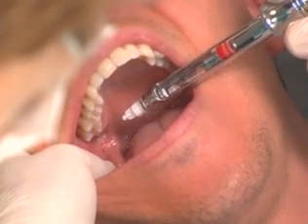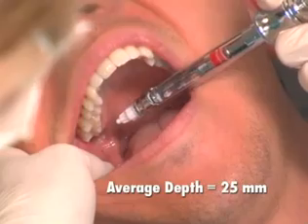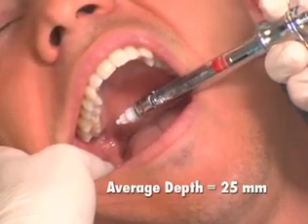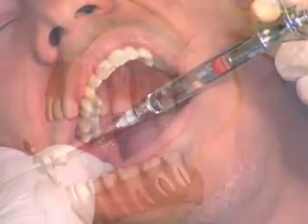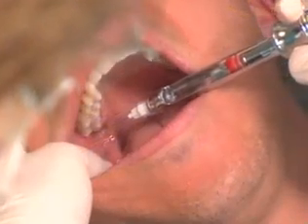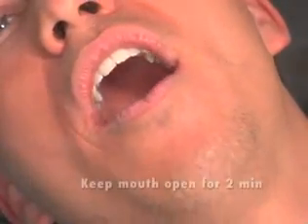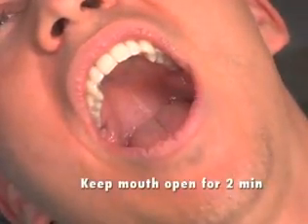The average depth of penetration in the Gow-Gates injection is approximately 25 millimeters. After negative aspiration, 1.8 mL of anesthetic is slowly administered. Following withdrawal of the syringe, the patient is asked to keep their mouth open for 2 minutes.